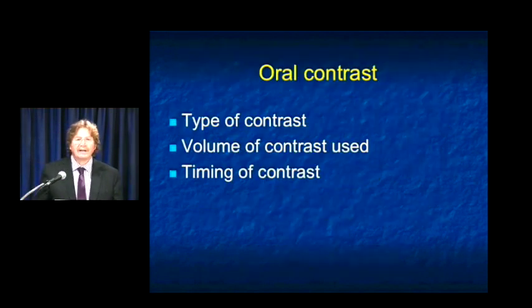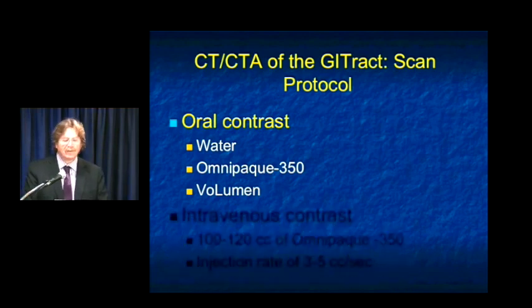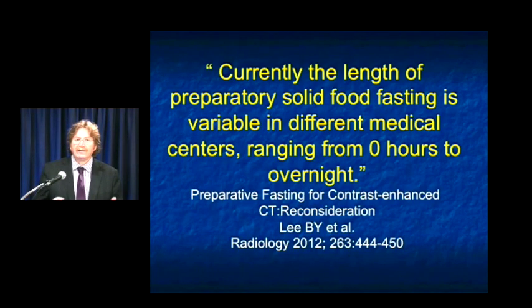When we speak about oral contrast, it's the critical things: type, volume, and timing. And theoretically, you can give water, oral Omnipaque solution, Volumen, and then you can give IV contrast. And again, if you speak about the oral contrast for a moment, what do we do? How long do we wait? An article by Lee made the point that some sites don't wait at all, and some sites give contrast overnight. It's really a kind of a conflict. For many things, you would love to give it overnight, but quite frankly, it doesn't work, particularly with outpatients. You can't have patients coming for contrast and going home. It doesn't work in a busy practice.